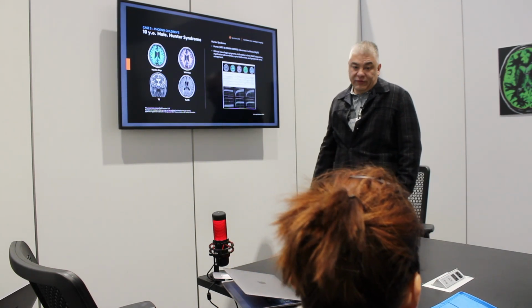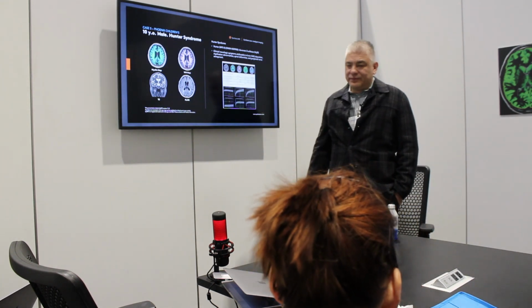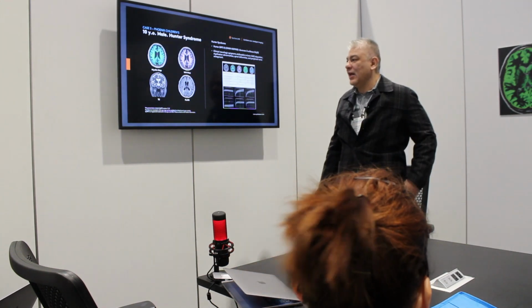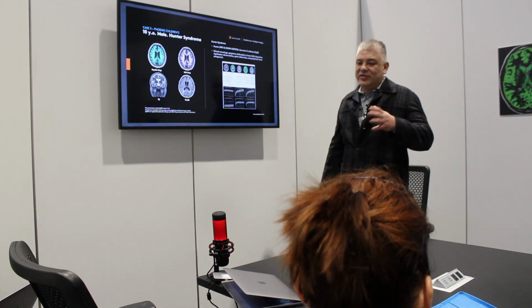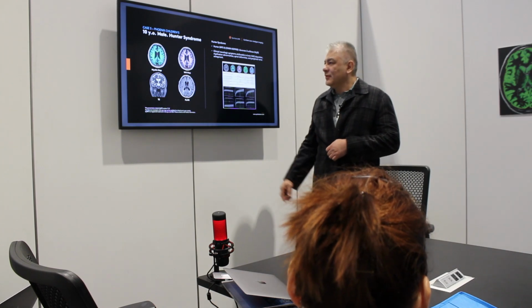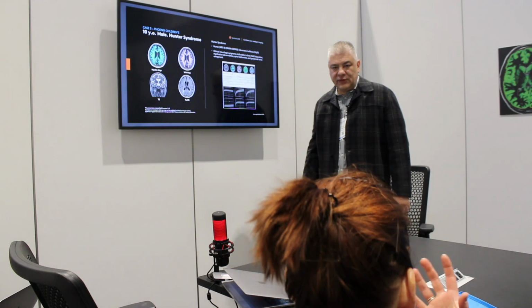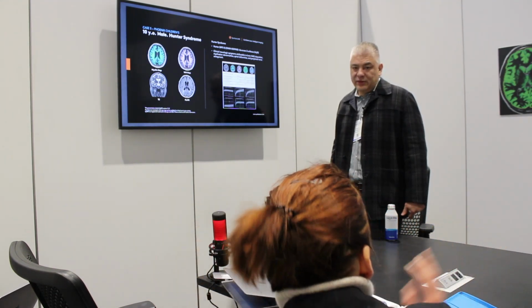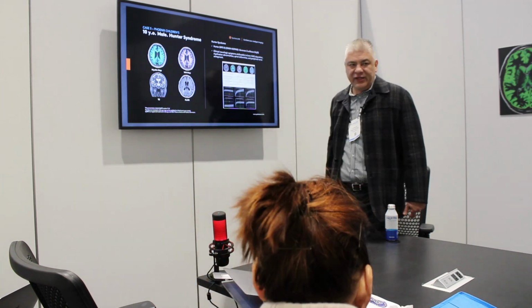I mean, oh yeah, you see this, you think it's an old man. Old lady. It doesn't look like a child. Yeah, no, exactly. And that's part of the syndrome, you have that diffuse volume loss, but we're not stopping at the volume loss. It's myelin. So now we can link that the loss in myelin is probably part of the volume loss. Probably the leading cause, because that's how the pathology comes, right? All this caused by myelination abnormalities.